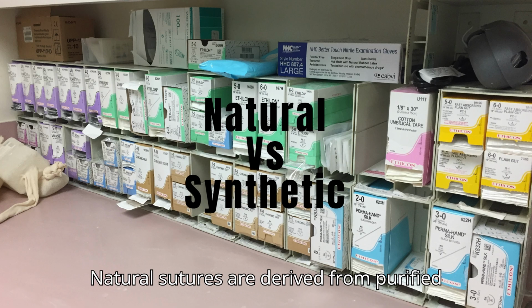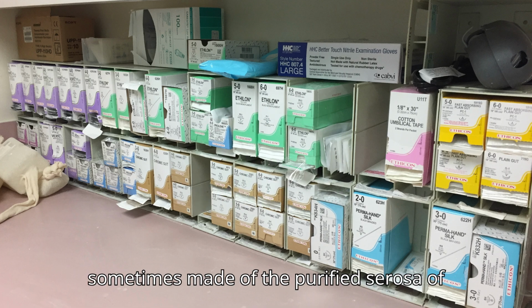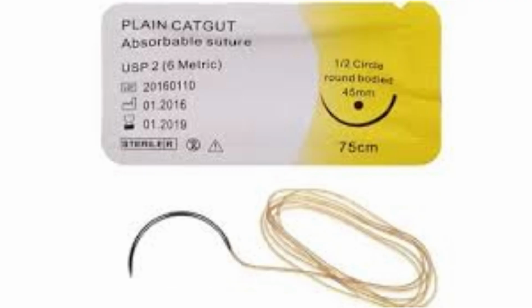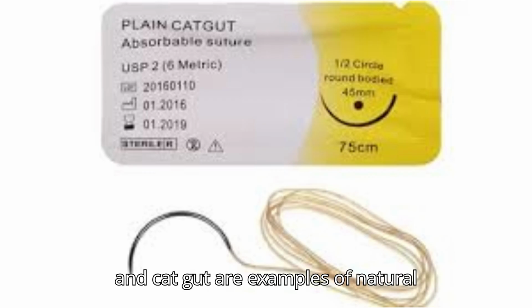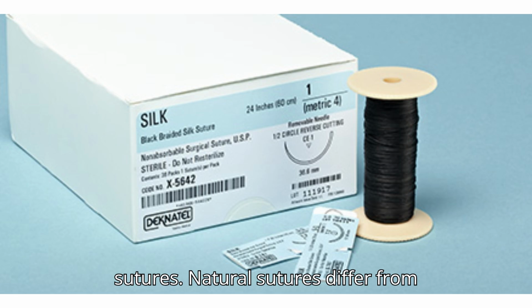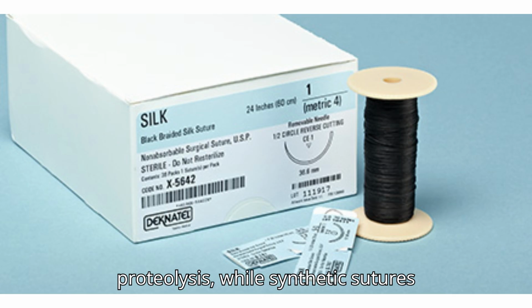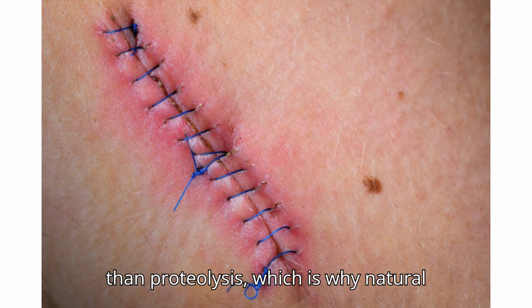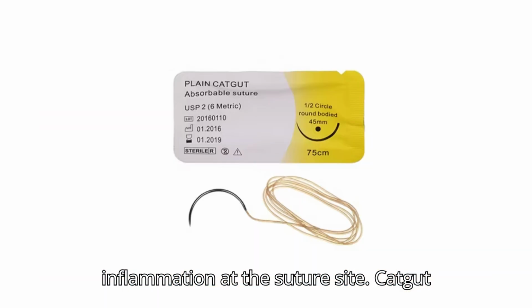Natural sutures are derived from purified animal tissues, usually collagen, and are sometimes made of the purified serosa of bovine intestines. For example, catgut is made from sheep gut. Silk and catgut are examples of natural sutures. Natural sutures differ from synthetic sutures in that they degrade by proteolysis, while synthetic sutures degrade by hydrolysis. Hydrolysis causes less of an inflammatory reaction than proteolysis, which is why natural sutures can be known for causing more inflammation at the suture site.